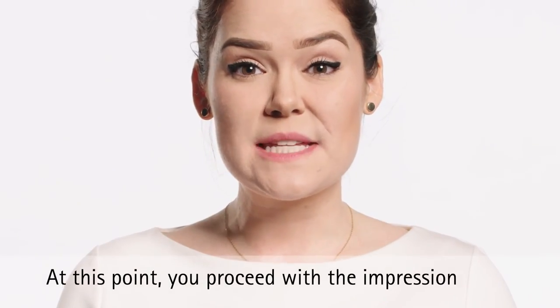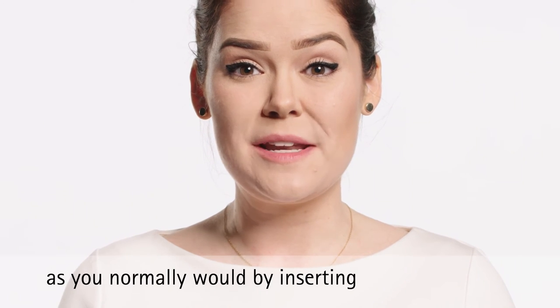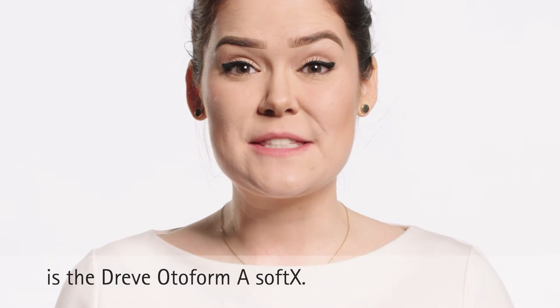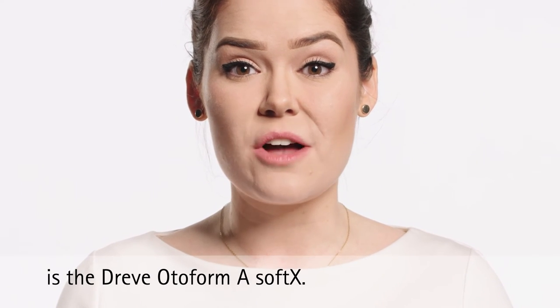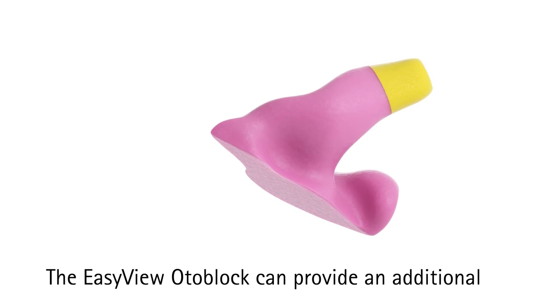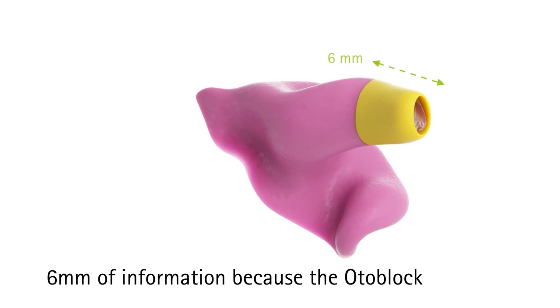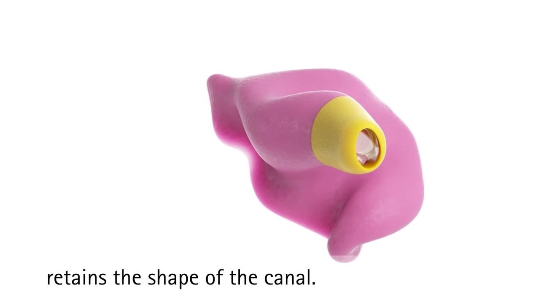At this point, you proceed with the impression as you normally would by inserting the impression material. The EasyView Otoblock can provide an additional six millimeters of information because the Otoblock retains the shape of the canal.